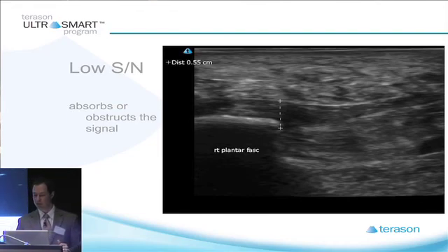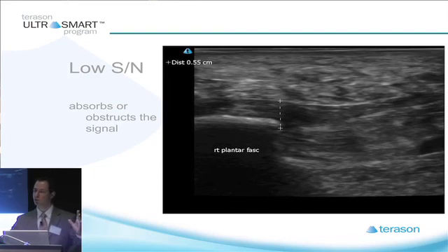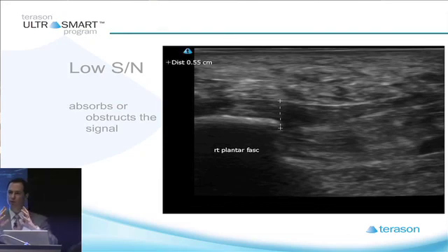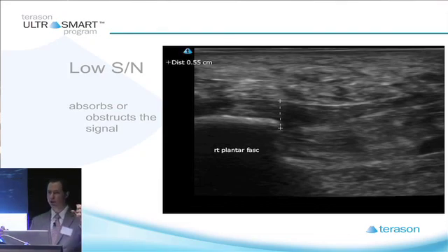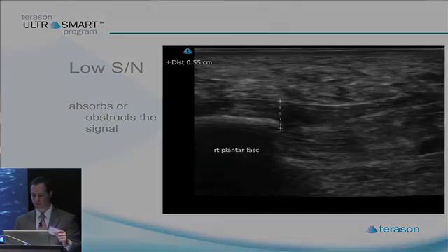In contrast, in other areas you see nice, crisp bright whites — like the bright white line at the surface of the muscle where it interfaces with subcutaneous tissue. But deeper down, everything appears more shifted toward the center of the grayscale. You don't get the bright darks or the bright whites anymore, and you lose your signal.